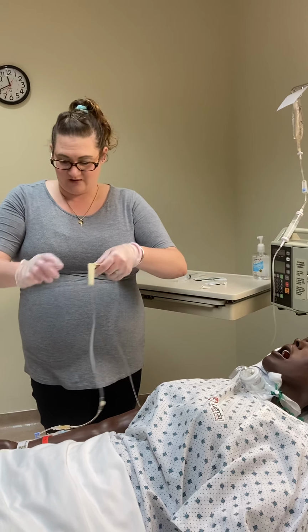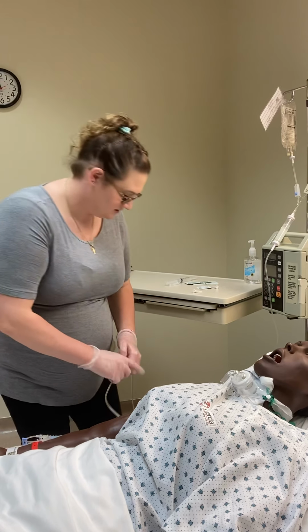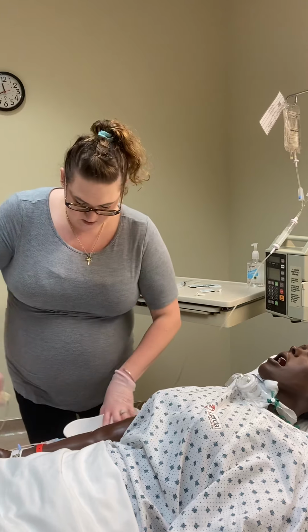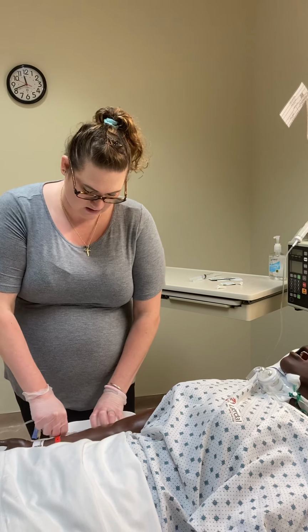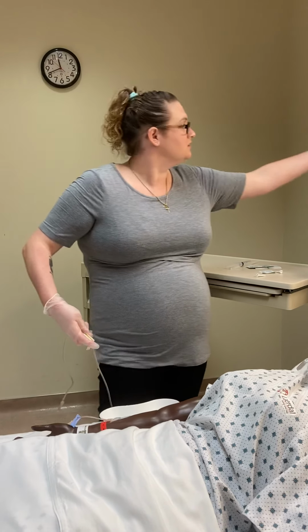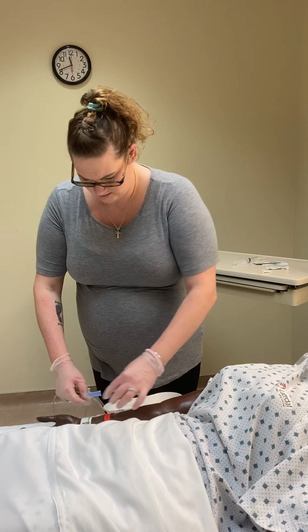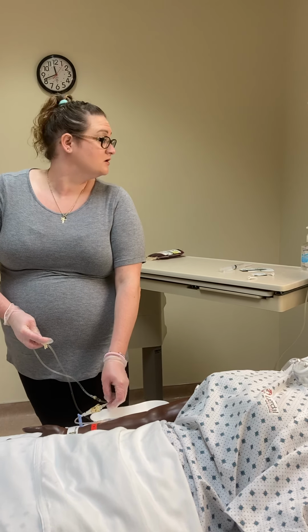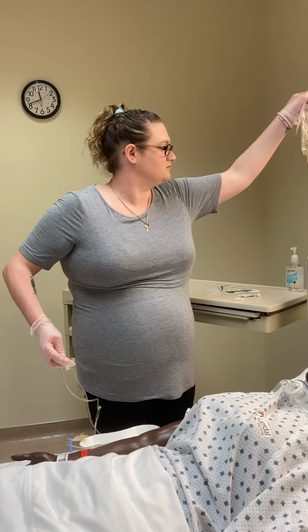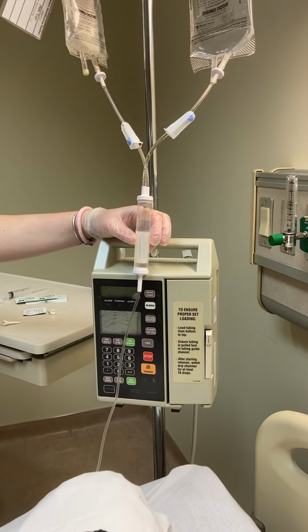All of this is saline right now, and I'm going to start to regulate my drops per minute. Just going to move this up here so I don't get the bed wet. So I'm getting my drops regulated, and I need to be at 20 drops per minute.